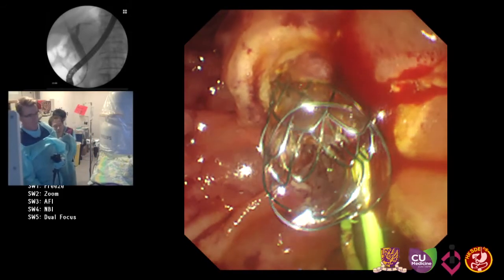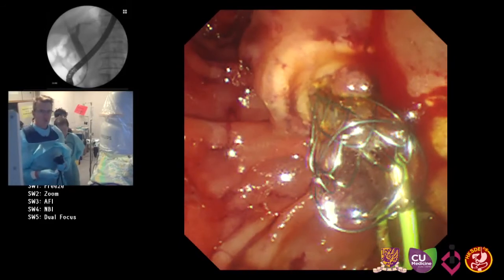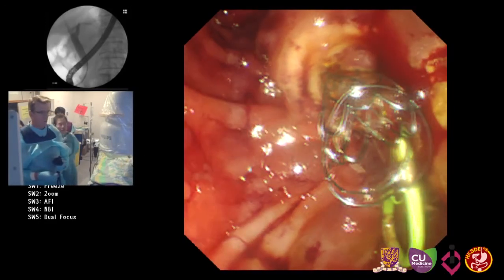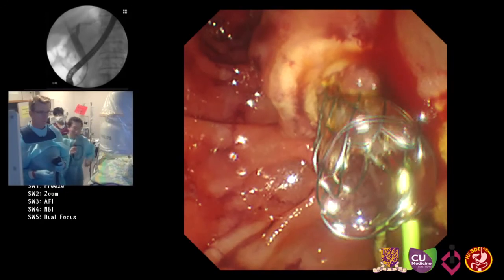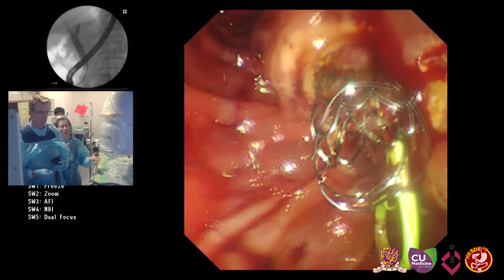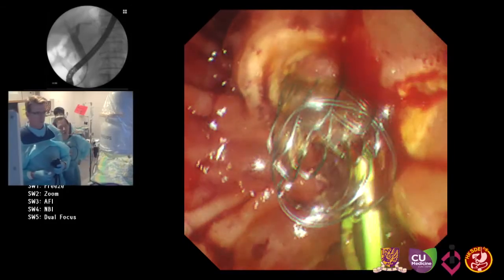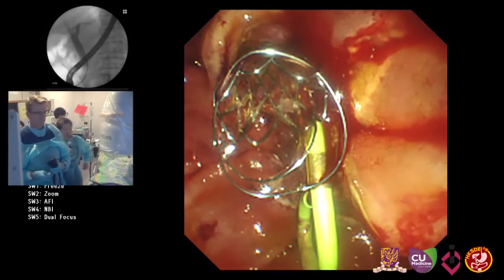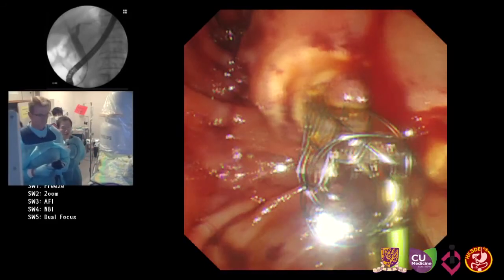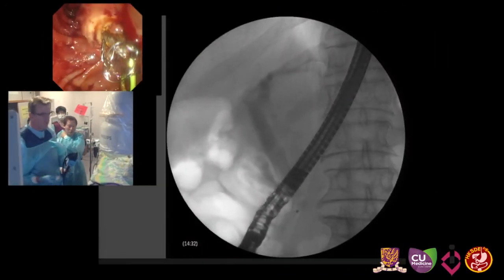Dr. Seo, do you think there's any use of doing an endoscopic ultrasound after doing an ampullectomy? Should you do an EUS when you're doing ampullectomy? After the ampullectomy? No, I don't agree with that, because after several months, we can repeat. But at this moment, we caused burn injury, those kinds of things. So even though you are doing EUS, there will be some edematous changes. So we cannot evaluate clearly the ductal structure at this moment. I'm not sure it would change the management.